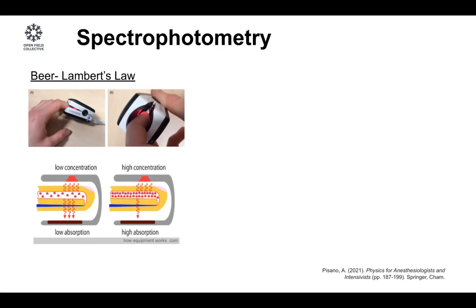In this case, it is infrared. It's the borderline of red and infrared, so that's why most of these devices have a red color in them. The reason you want red light to do this is because it has a larger wavelength, so it has longer penetration power. So it can go through your skin and a small piece of tissue like a finger.